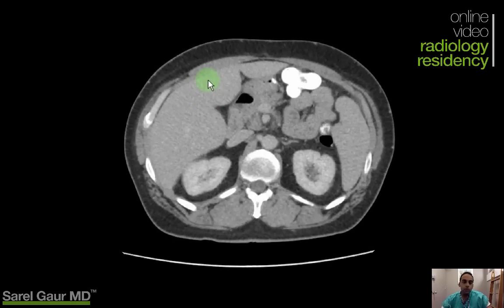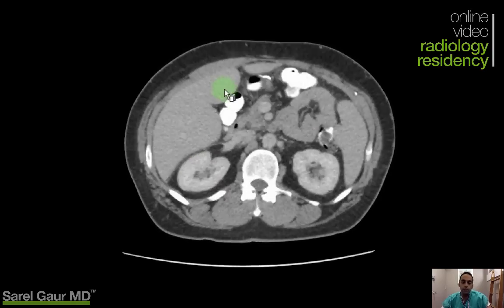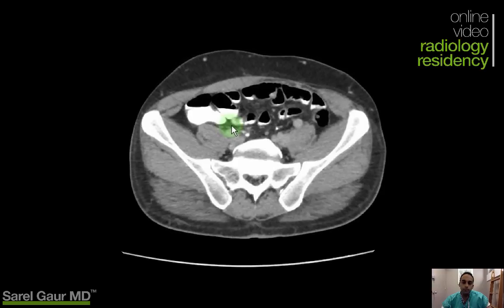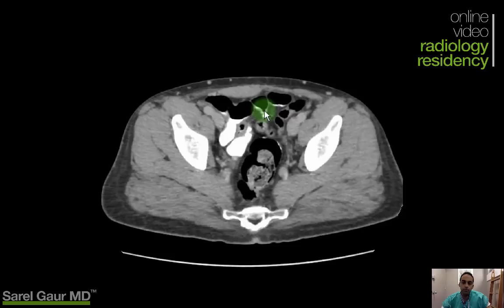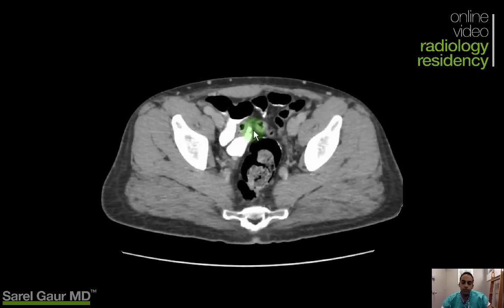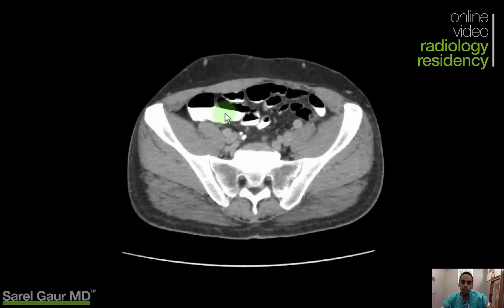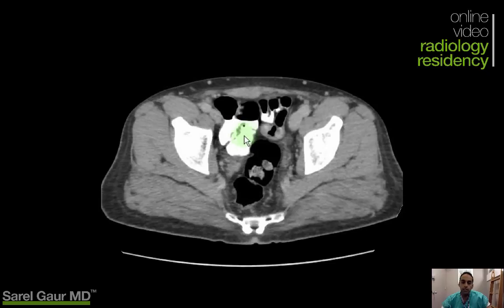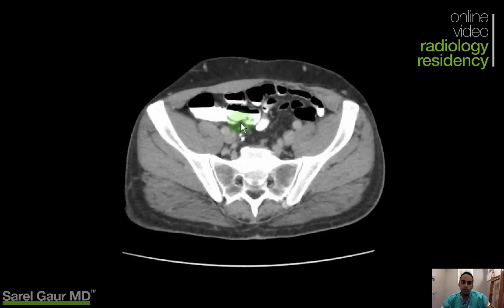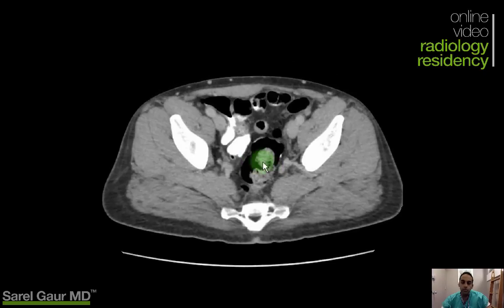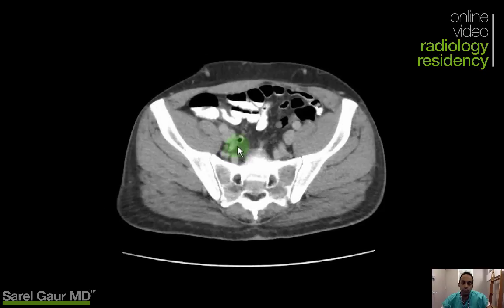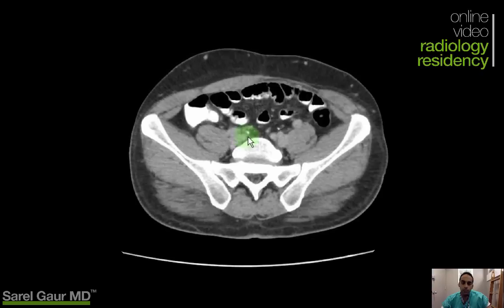Here's another case: 41-year-old male, right lower quadrant pain. Scrolling down, looking for the appendix. In this case, the cecum is low-lying — it's kind of in the pelvis. On this slice I can see there's probable cecum over here and sigmoid colon here. I'm seeing a small air-filled structure which looks like the appendix.